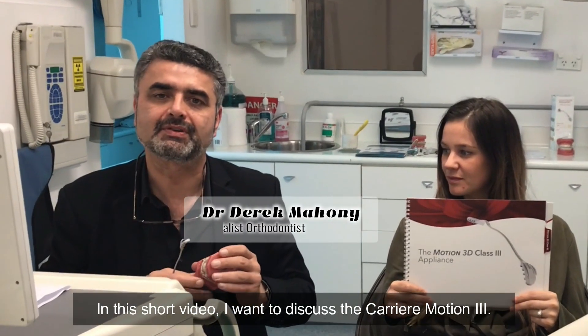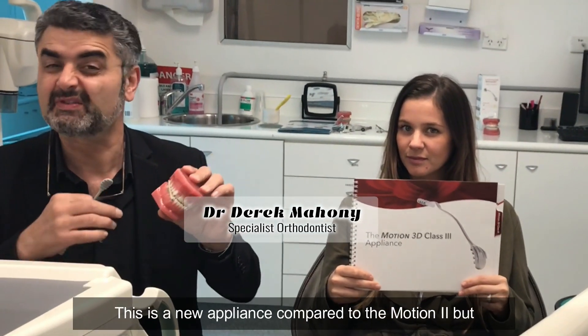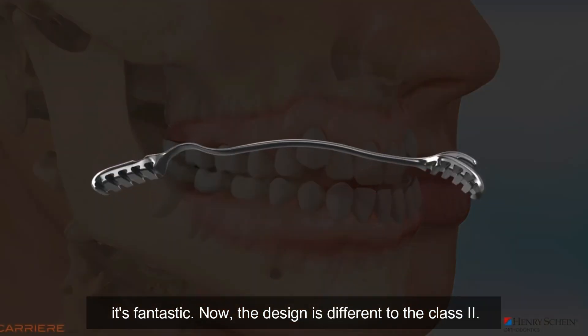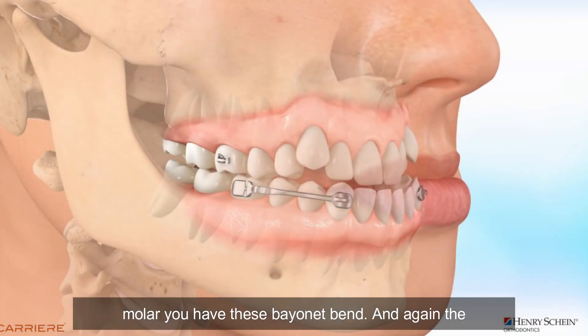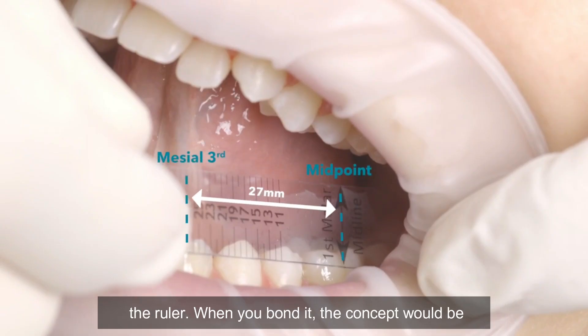In this short video I want to discuss the Carrier Motion 3. This is a really new appliance compared to Motion 2, but it's fantastic. The design is different to the Class 2 — there's no ball joint. Mesial off the first molar, you have this bayonet bend, and the measurement is very similar to what we do in the upper with the ruler.